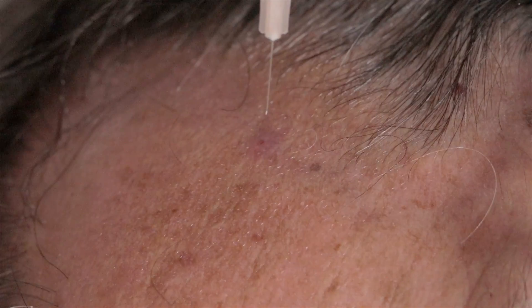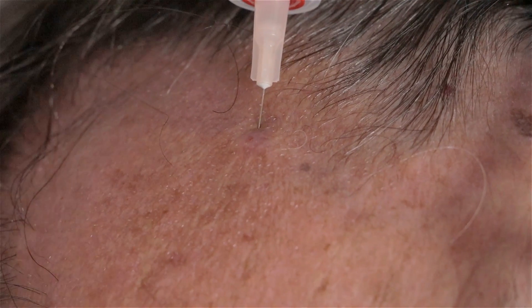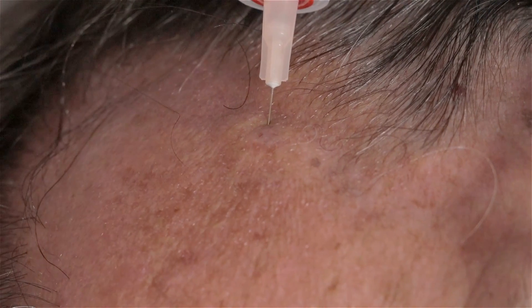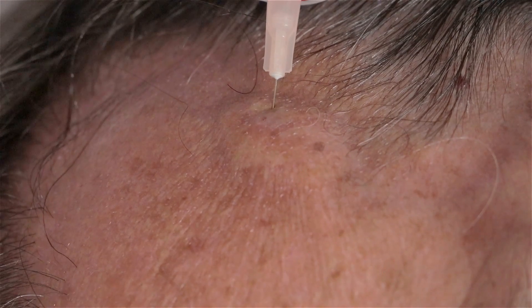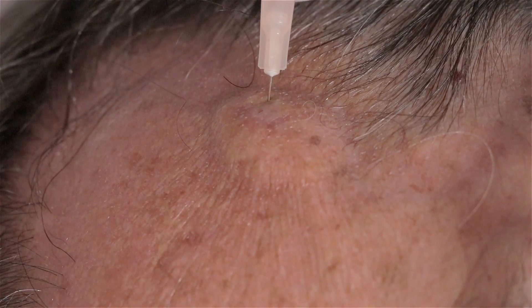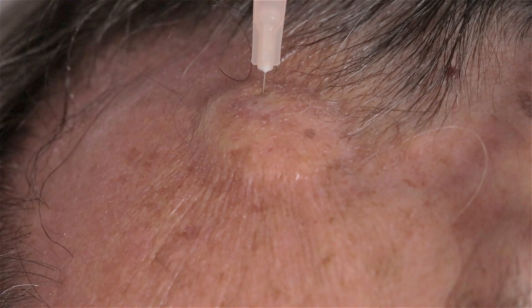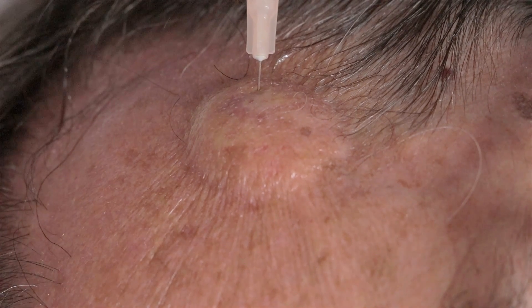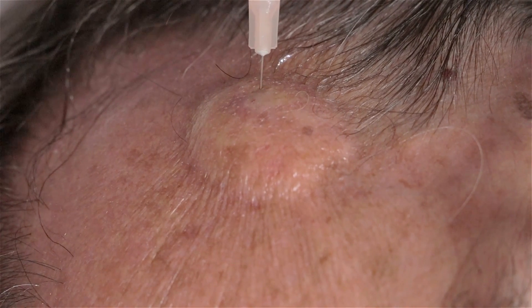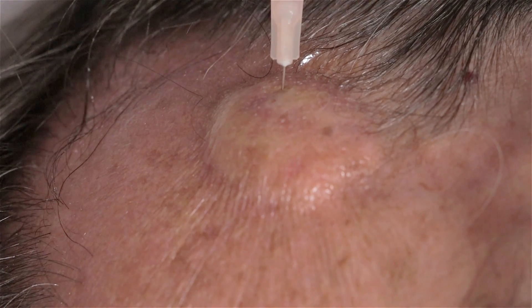It hurts to get a shot — I apologize — but we do use techniques and medicines to help minimize the pain. One of those is bicarbonate to buffer it so it's not as acidic; it doesn't sting as much. Slow injecting helps as well. I inject a large amount for a couple of reasons: one is it gets the area good and numb, and the other is it kind of raises up the lesion to make it easier to catch with the biopsy instrument.